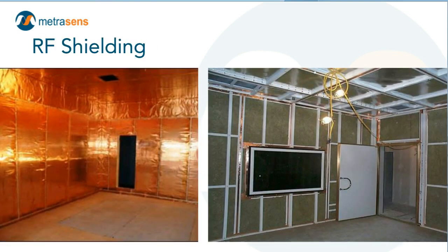This is nothing more than a visual aid to show you a couple of different forms that radio frequency shielding can take. The one on the left that looks like you're inside a copper Jiffy Pop, you in fact are. You're inside a copper enclosed room. Walls, ceilings, floors, doors and windows get special treatment to make sure that they are radio frequency shielded as well.